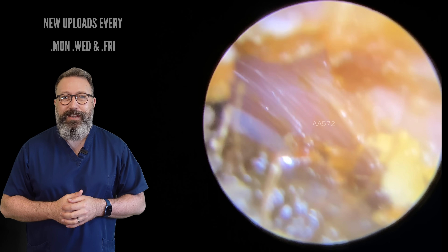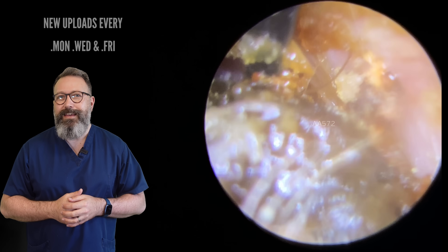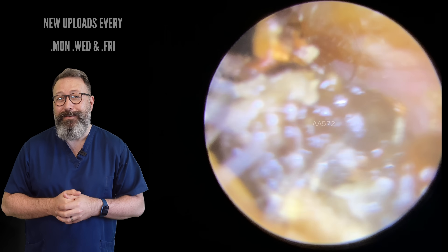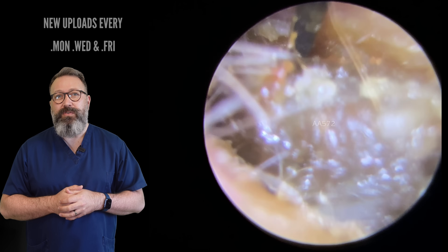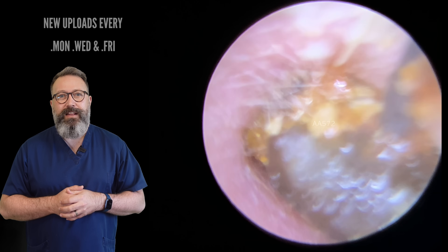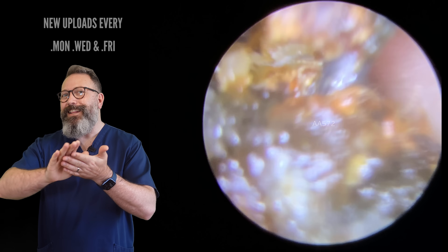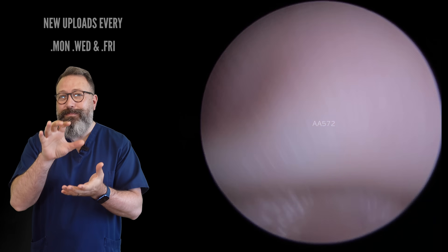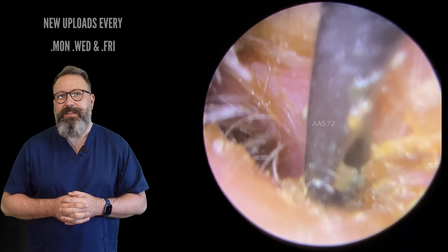See if you can spot it. You can see it is tough as old boots — it does not want to come out of that ear canal. There we go, let's draw this forward. It's just lots and lots of wax, varying in colour. Possibly just underneath there was a slightly lighter sheen to it — you might have to rewind to have a look. But that was the plug that contained the foreign body.